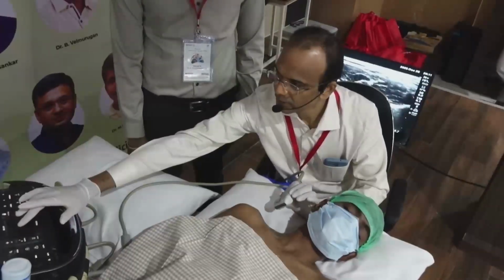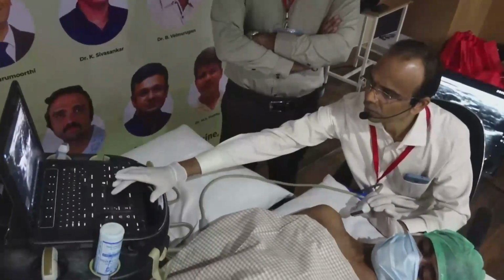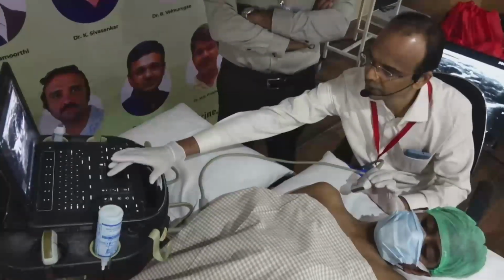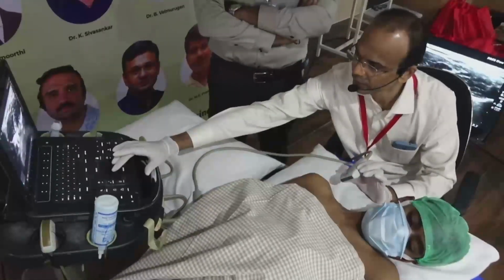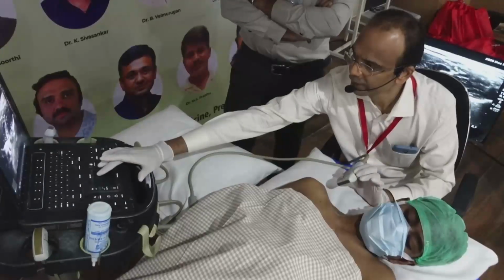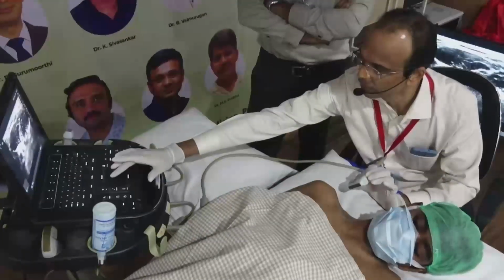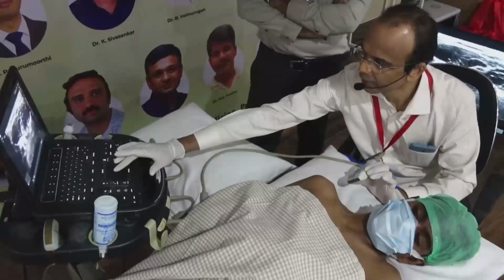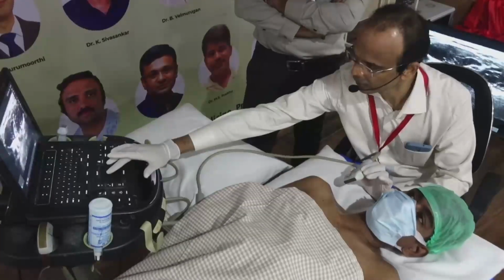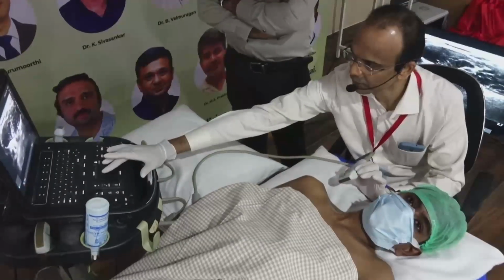previously it is called something like traffic light sign or stop light sign. So this is, people think, sometimes if you are not systematically scanning and tracing, people might think this is C5, the next one is C6, next one is C7, and they might think this is C8 and T1. This can be easily misinterpreted like that.